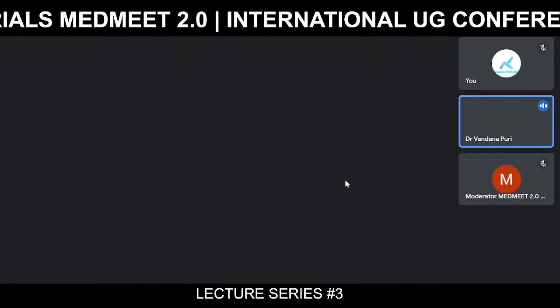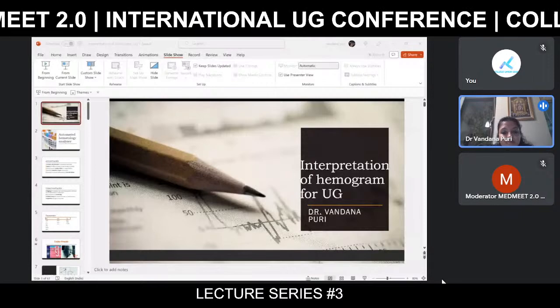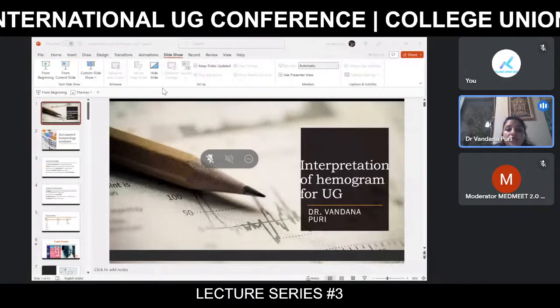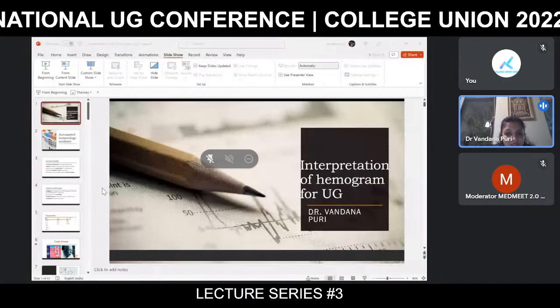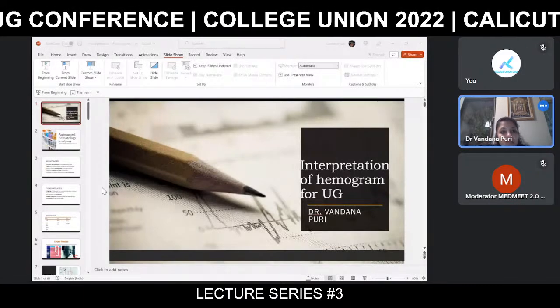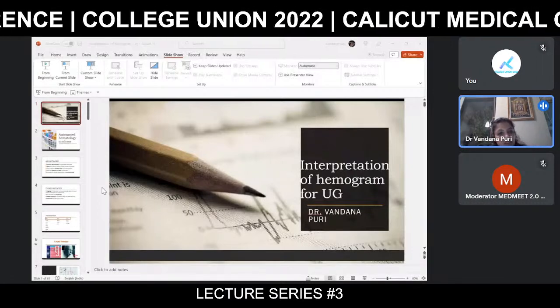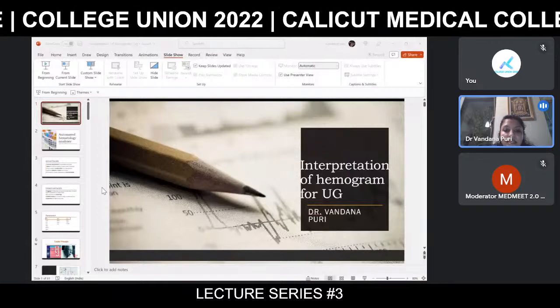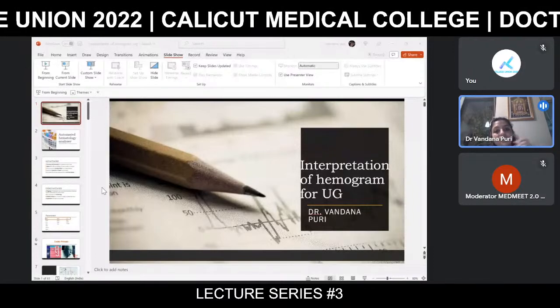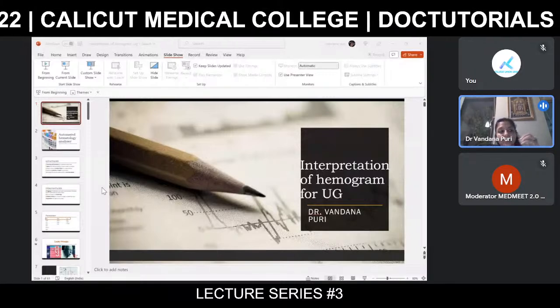So there was a person called Wallace Coulter who designed a simple machine saying that if a blood cell is passing through an aperture, we can measure it. The principle was called electrical impedance. What was electrical impedance? Whenever any cell passes through the aperture, the number of times it passes will give you the number of cells. So suppose their platelet count is 1 lakh. How do you get a 1 lakh count? Because 1 lakh times, pulses of cells are passing through that aperture and it will give you the number. What about the height of the pulse? That cell will also create a height.